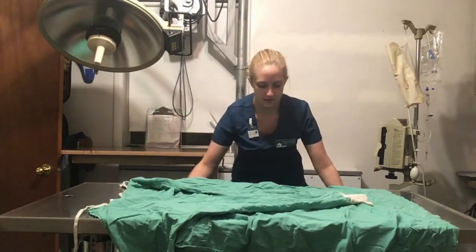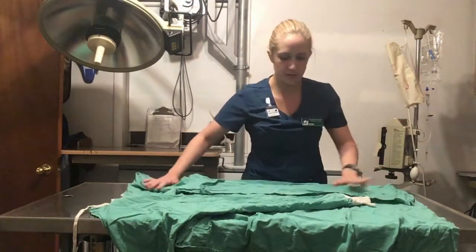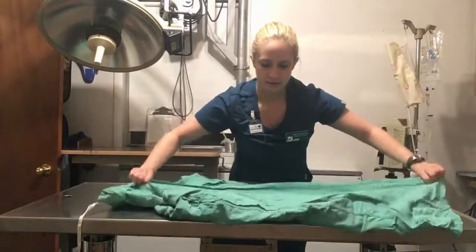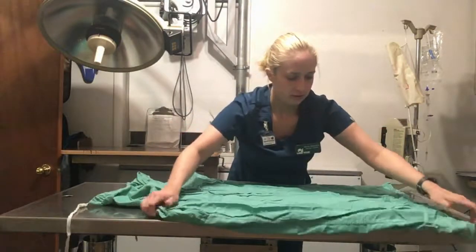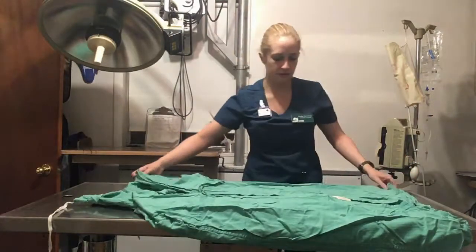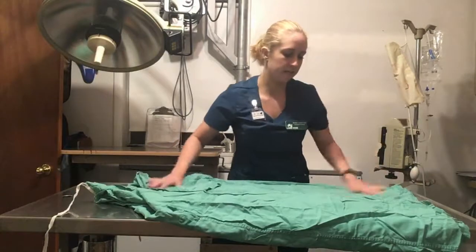Alright, and once you've done that, you can take the sides and fold those in as well, to where the two sides meet in the middle.